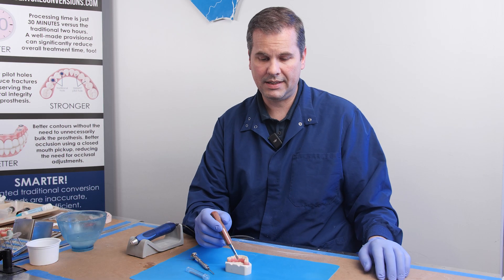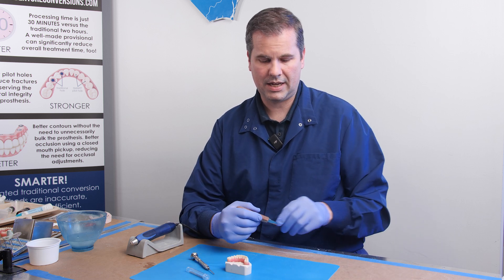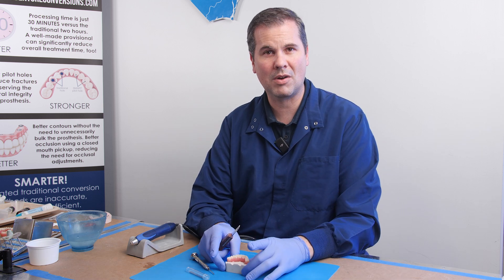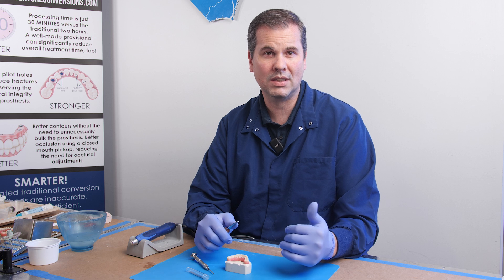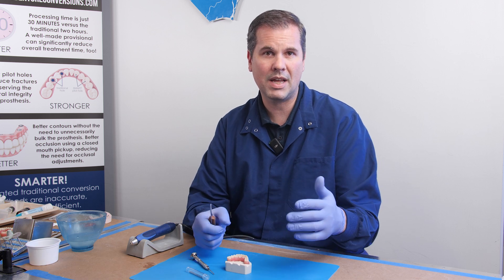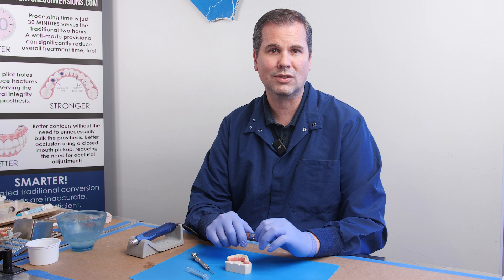We've now made a stone model, duped it in alginate, and are ready to create screw channels. One of the reasons I like to teach new users to actually make a physical model is because there's a risk you will overheat the temporary cylinder in the prosthesis and dislodge it. So if you have a physical model to go back to, you can repair it on the model rather than having to go back to the patient's mouth. Now that we've got this physical model, I feel comfortable proceeding with the screw channels.